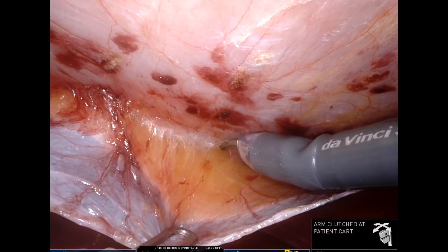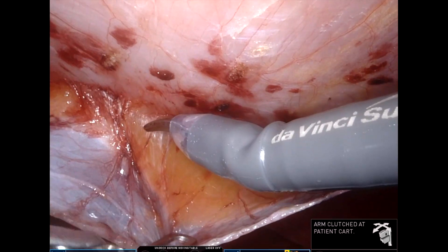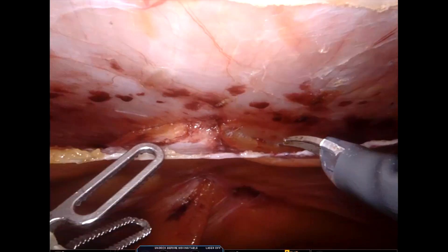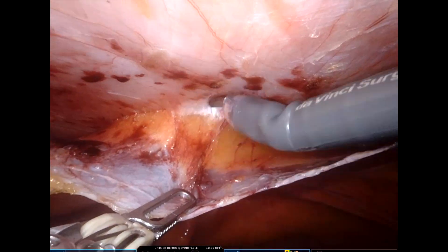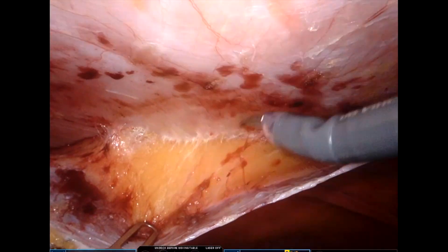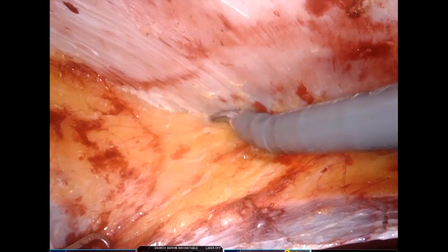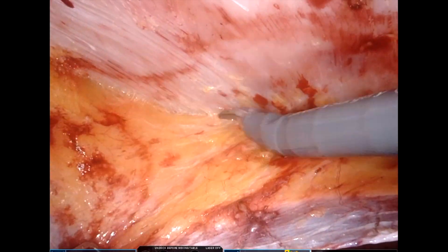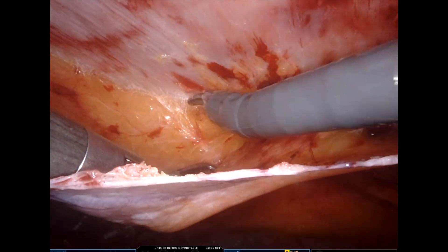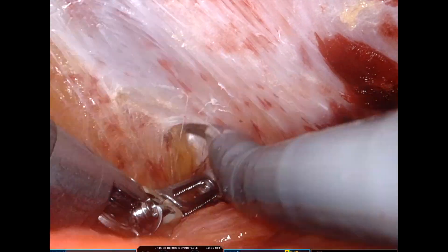Patient selection is important whenever we are starting to do TAPPs for ventral hernias. Male patients with a BMI around 30, small hernias with minimal or no rectus divarication, are good to start with. It is always tough to do TAPPs in patients with large divarication.